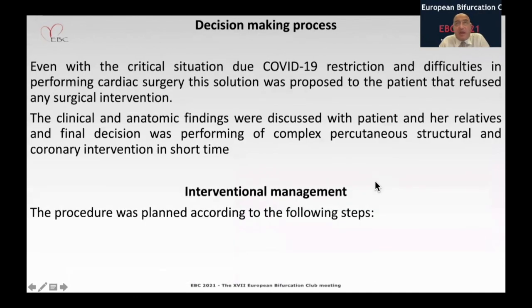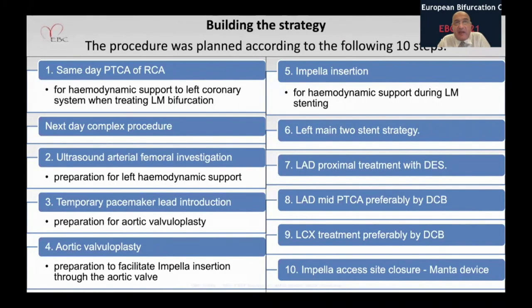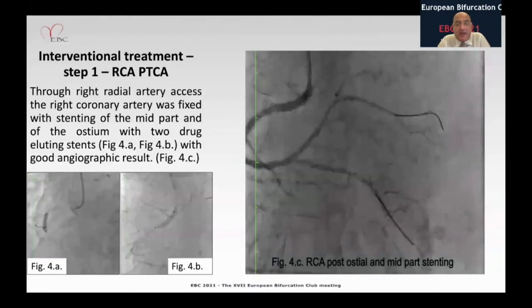The patient came in February 2020. The plan was PTCA of the right coronary artery. The next day, after vascular evaluation, Doppler evaluation of the iliac arteries, we would perform aortic valvuloplasty to facilitate the Impella placement, and left main treatment with two stents, a double stent treatment of the left main, and possibly treatment of the circumflex and the LAD with drug eluting balloons. And then obviously removing the Impella and closing the access site.